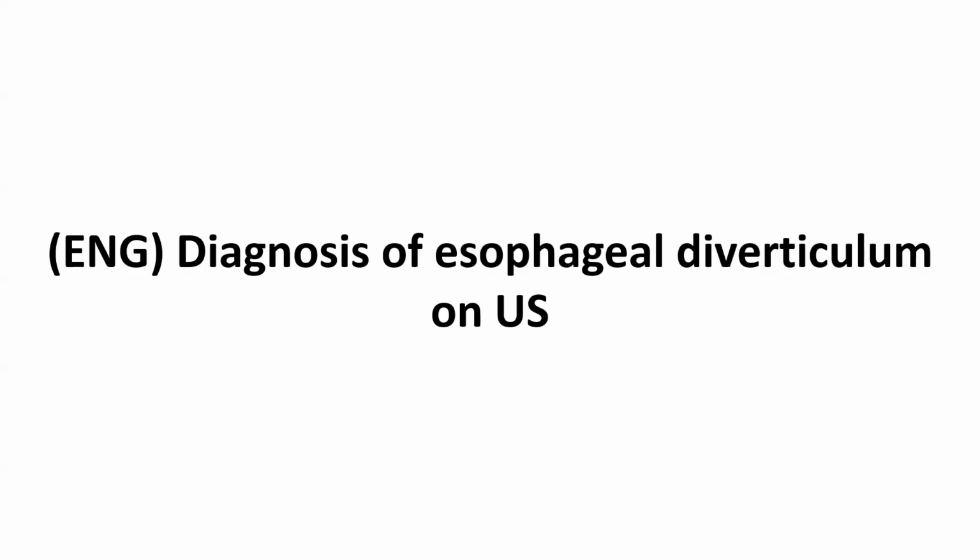An important point to emphasize is that misdiagnosing an esophageal diverticulum as a thyroid nodule and performing a fine needle aspiration or biopsy can lead to serious complications. Therefore, accurate diagnosis of this condition is crucial.